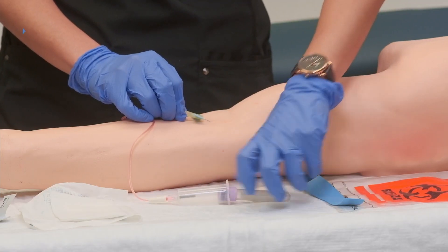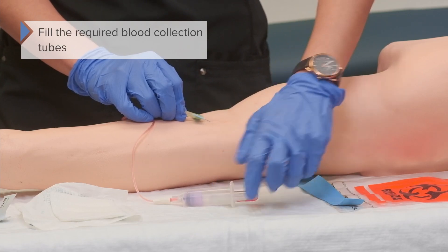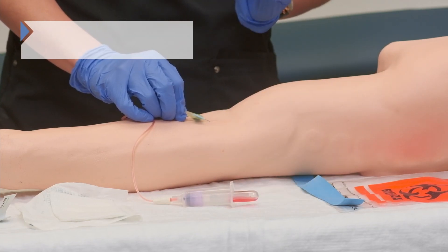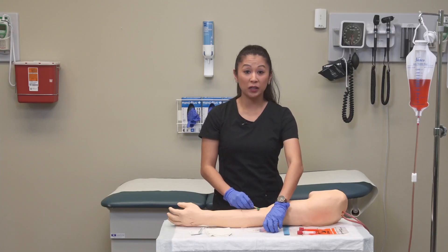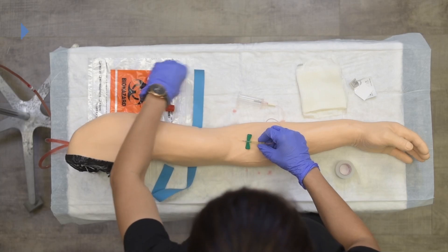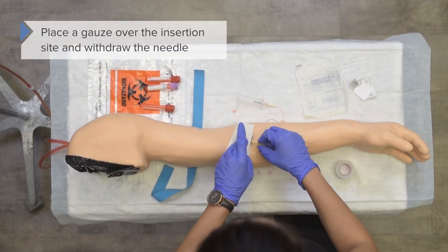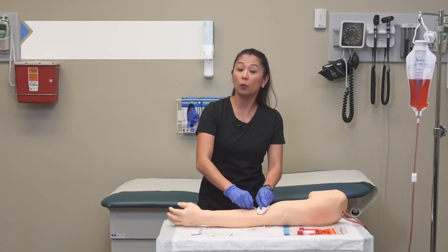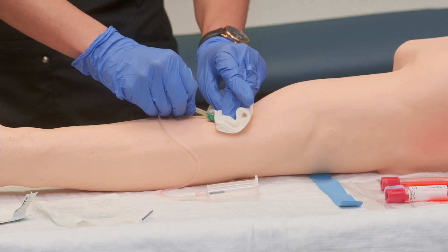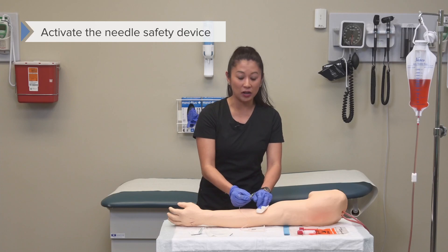Stick the lab tube in, push it all the way until it punctures, and make sure it fills appropriately. Once we've got our blood collection tubes filled, remove them and place the gauze over the insertion site. Then go ahead and withdraw the needle, pulling it straight out. It's really important to activate the safety device.